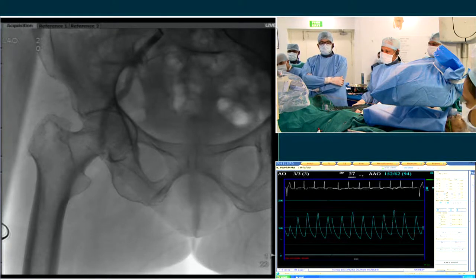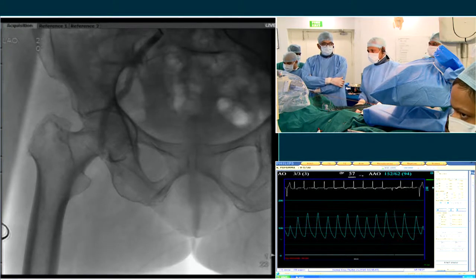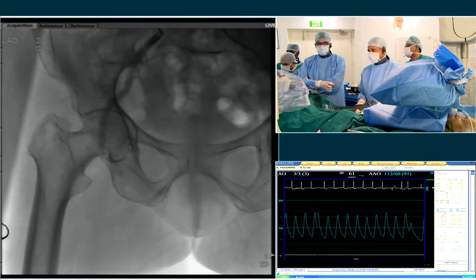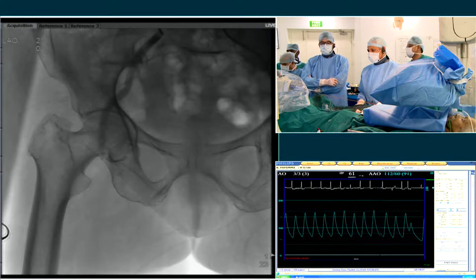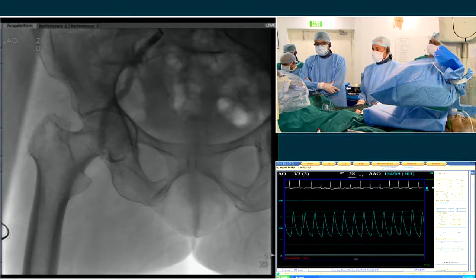In a type 1 bicuspid, if you have a calcified raphe, you may not fully expand. Here, although it's a type 1, the raphe is not that calcified, so I don't have concerns about the balloon expandable circularizing. Remember, a balloon expandable is sort of intra-annular, so if you don't circularize the valve and you have very heavy calcium, then you're going to be elliptical, and that's going to really impact not only your gradients potentially, but also durability, because you'll get leaflet malcoaptation.